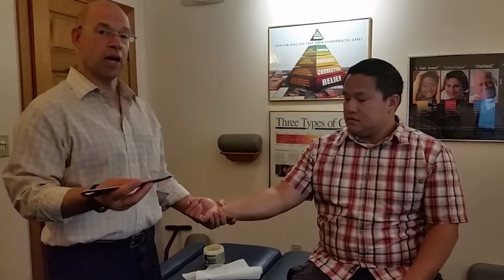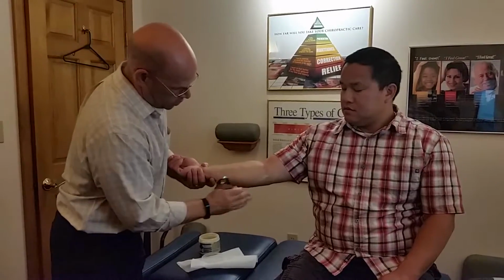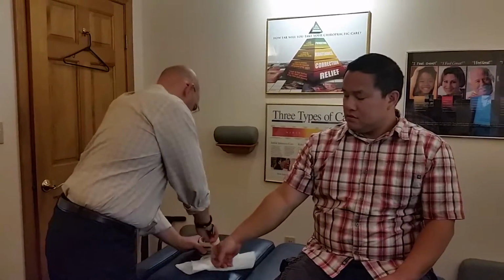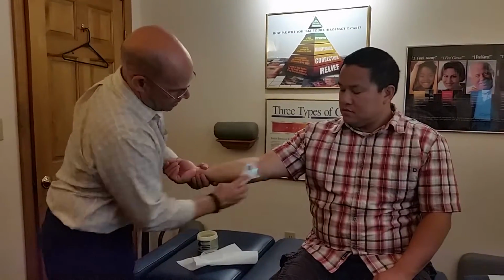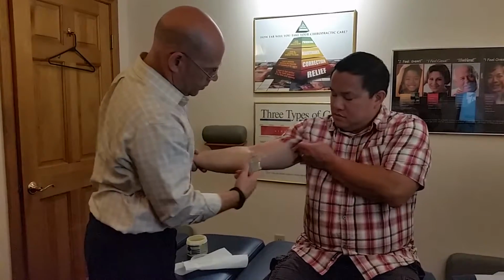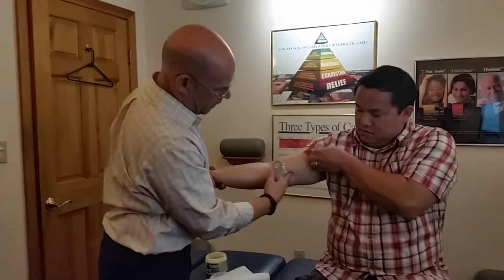I wanted to demonstrate the IASTM technique, instrument-assisted soft tissue mobilization, with a dulled edge metal steel tool and an ointment. In this case, you can use beeswax, or you can use shea butter like I'm using right now, so we don't irritate the skin. And basically, the ulnar nerve comes down under the bicep and over the tricep in here in the fascia.